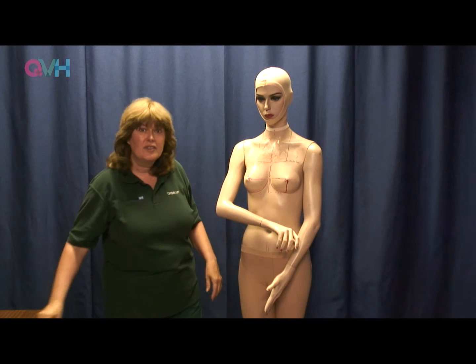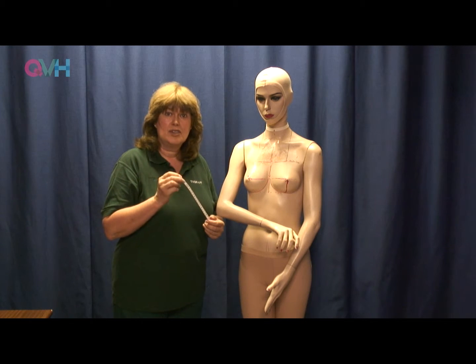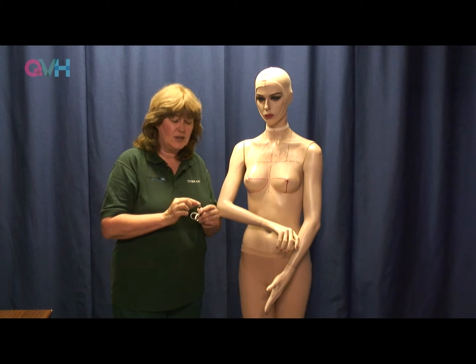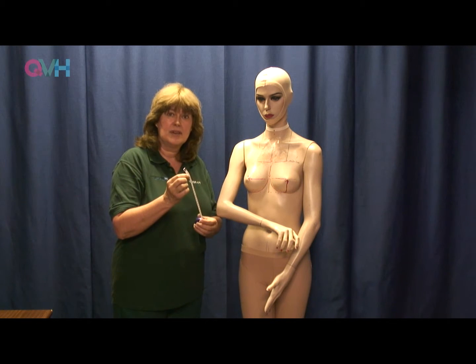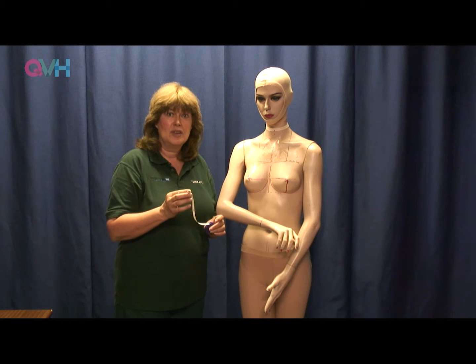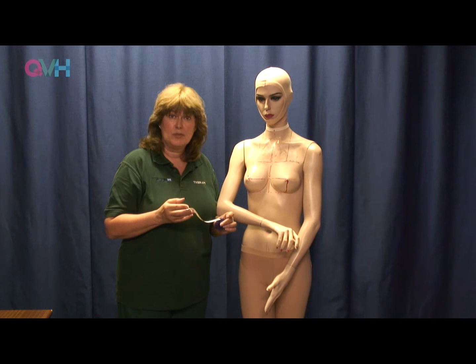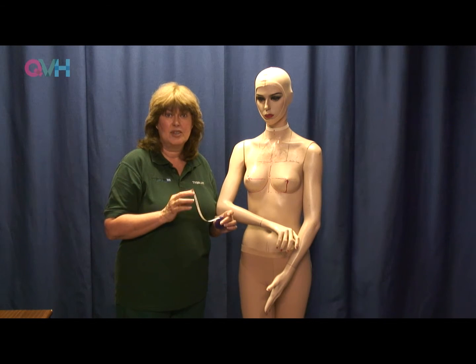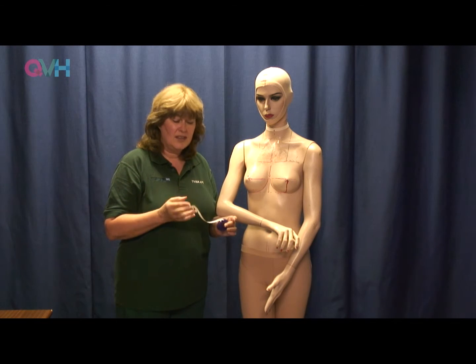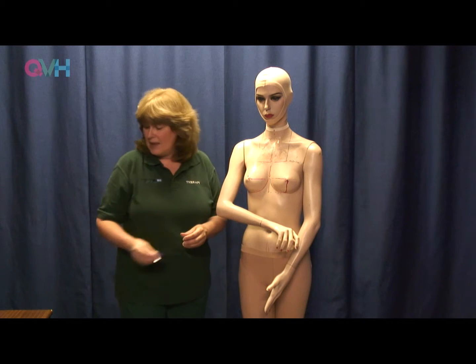Now, one of the first things I always need to point out is to use a good tape measure, one that doesn't have an extension beyond the first number. We often use the retractable ones, but of course when you're measuring a patient you need to worry about infection control, so you would probably be using the disposable paper tape measures. But in this instance, I'll show you on a normal tape measure.